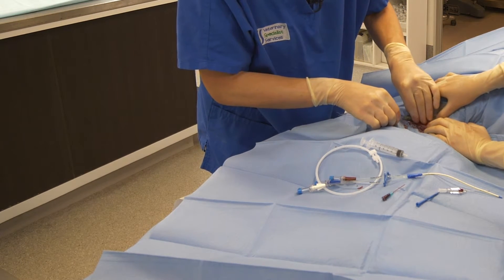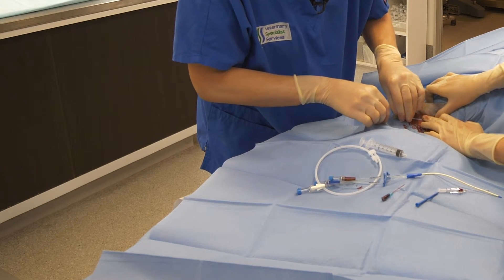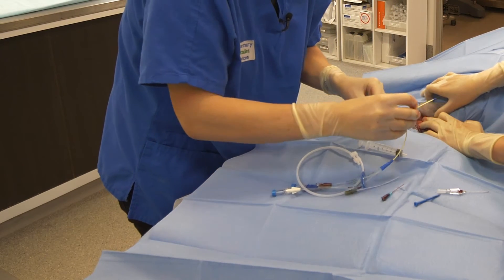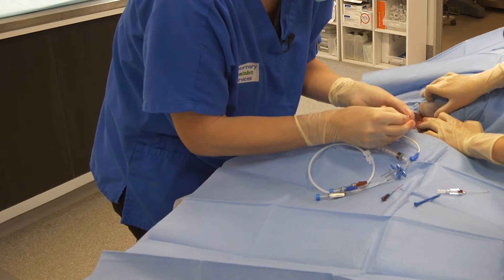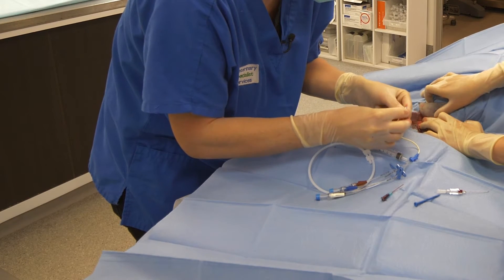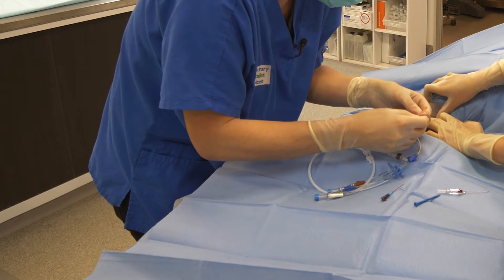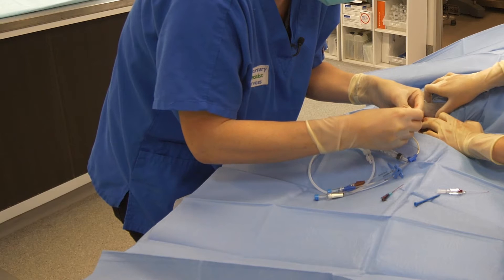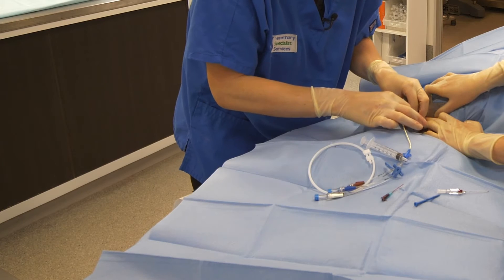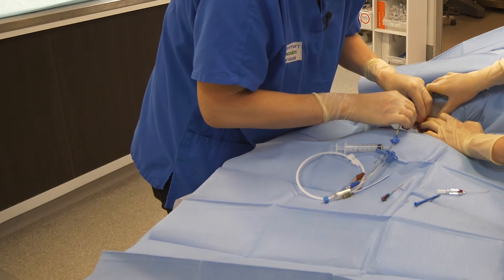Okay, and then we remove the dilator and place a little bit more pressure. And then insert our catheter over the guide wire.